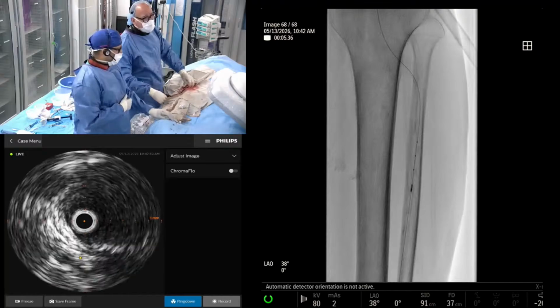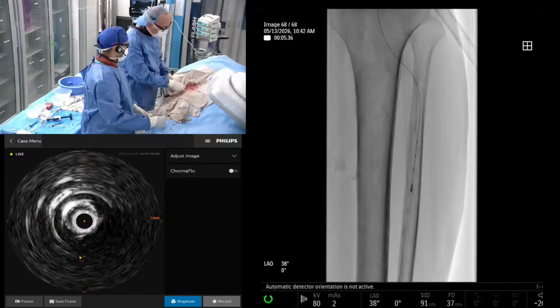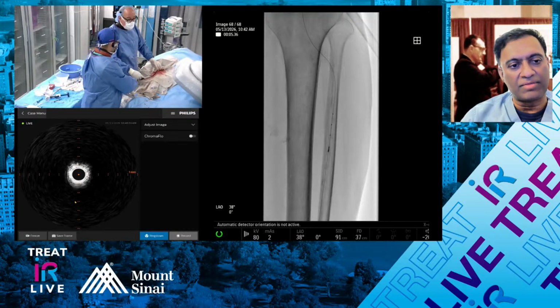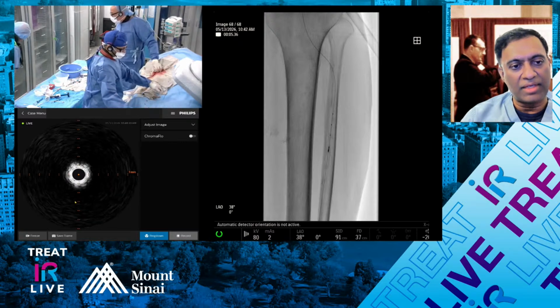And then we'll do an angiogram, and then I think we're going to try and wrap up here, right? So before you deploy these, what's your vessel prep? Say you're putting a 3.75, do you have to pre-dilate a certain amount to get adequate luminal gain?